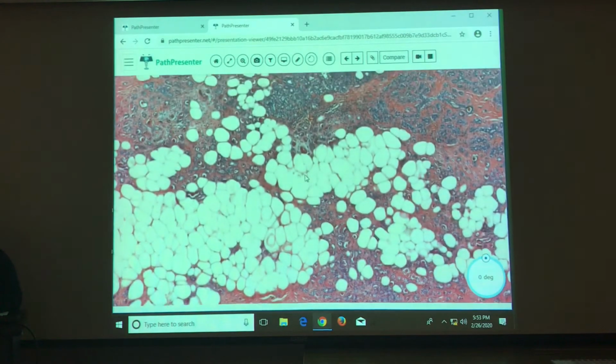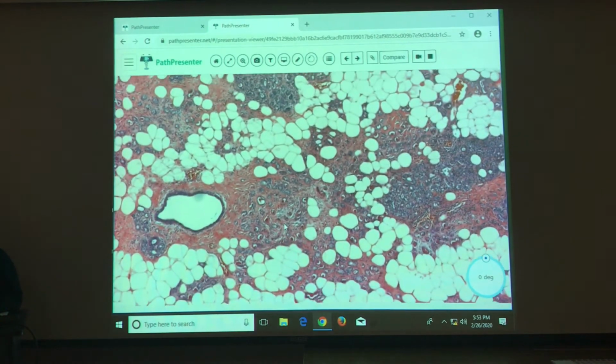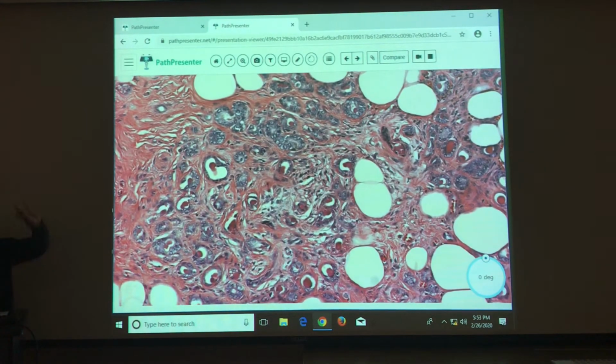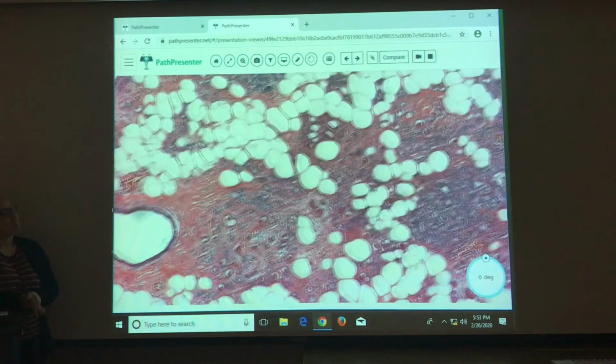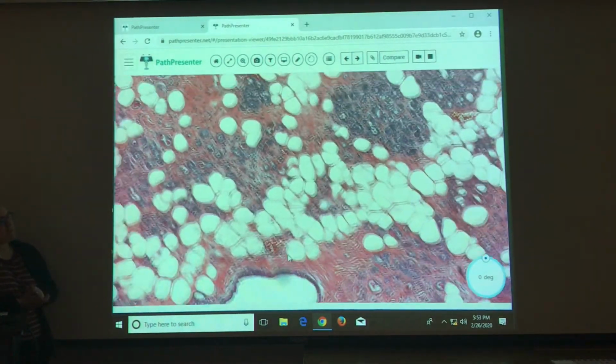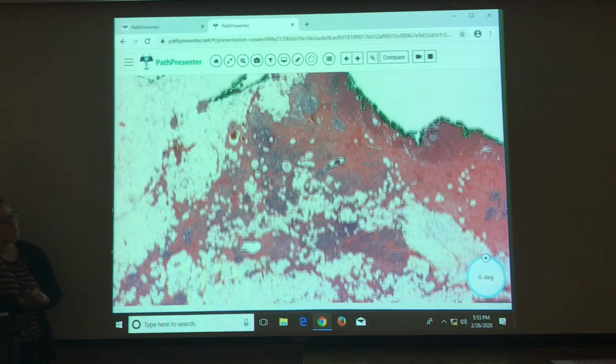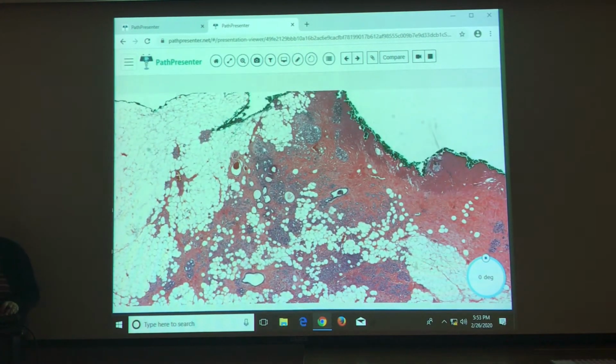So this one, I'm pretty sure is the microglandular adenosis. Yeah, so you see how this one looks terrifying? This lesion is commonly misconstrued for invasive cancer, and you can see why. This faded area looks a little concerning at low power.